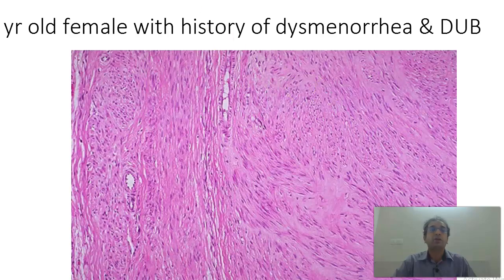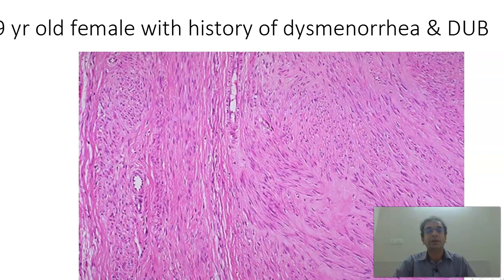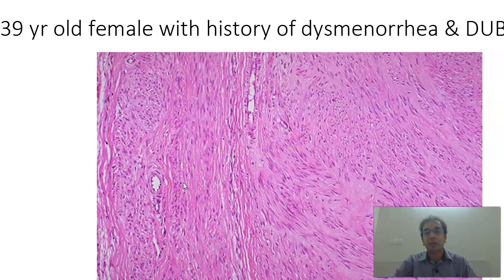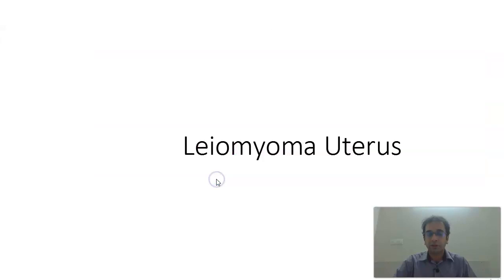Next, history of a 39-year-old female with history of dysmenorrhea and dysfunctional uterine bleeding. What you find here is a nice tumor comprised of smooth muscle fibers in crisscrossing fascicles. This is likely to be a leiomyoma. A leiomyoma slide can also be kept for hyaline change.